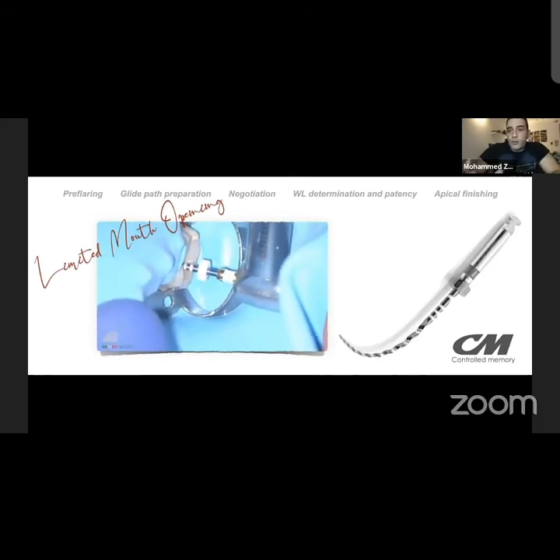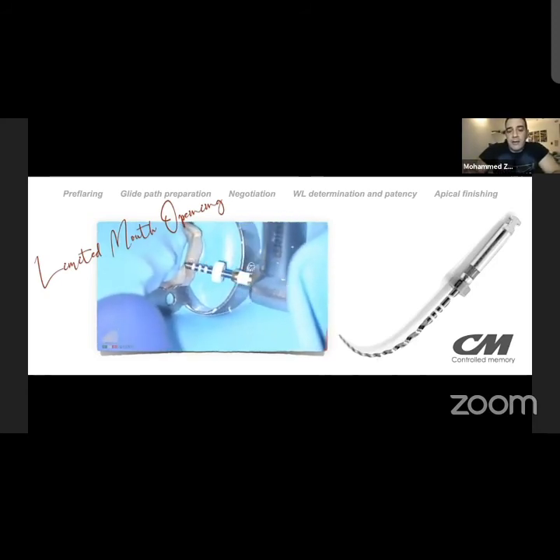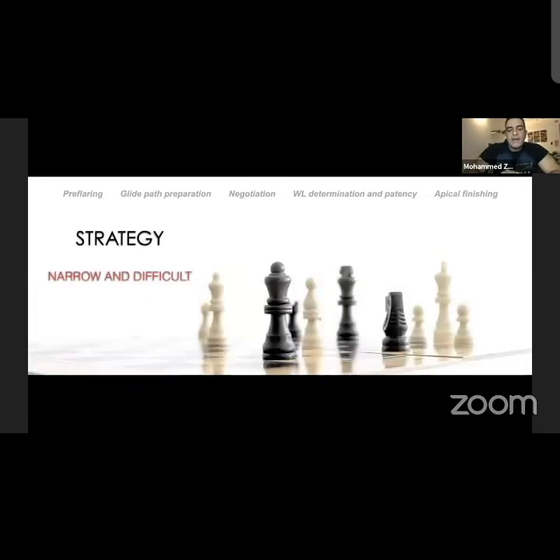Now, I'm telling you the sequence that we need to know for root canal preparation using the essential kit from Fanta by Stelteriano selection. What is the sequence during preparation of narrow and difficult canals or regular canals?